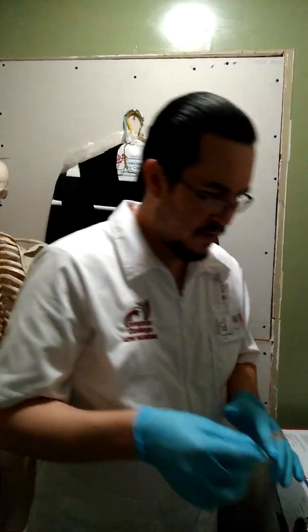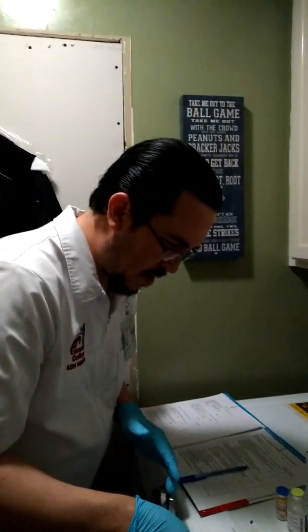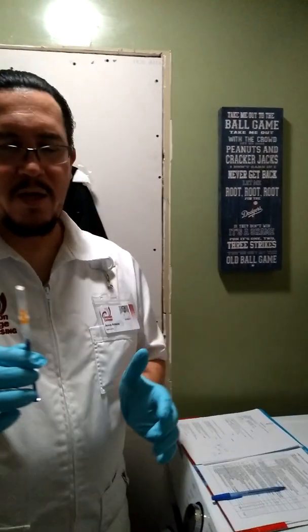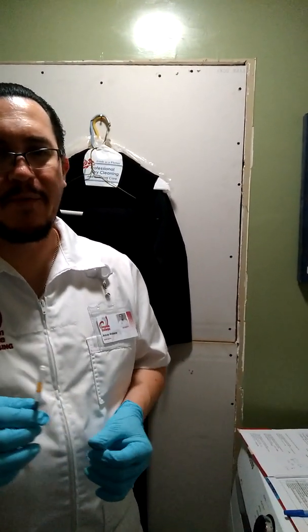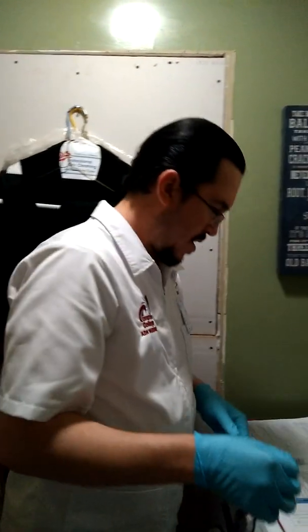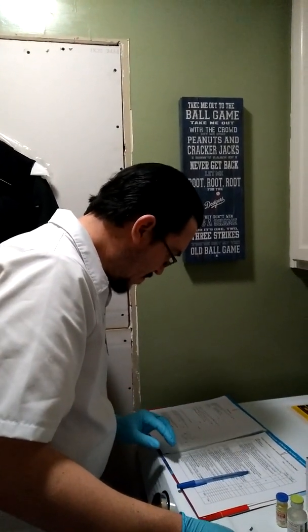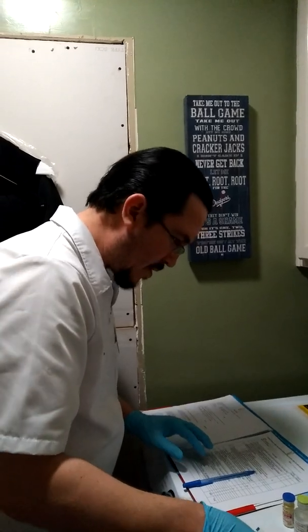Next, I'm gonna handle equipment without contaminating the plunger. I don't need to change the needle because it's a one-time use. So I'll just make sure to scoop, close it, and we're done. We check the calculation of medication again with MAR. Everything looks good. Yeah, everything looks good.